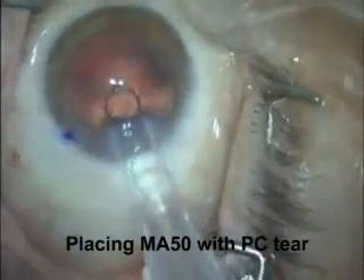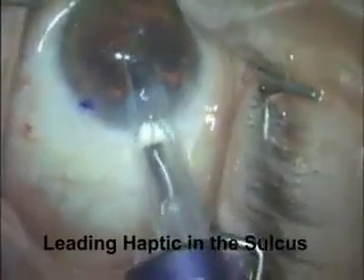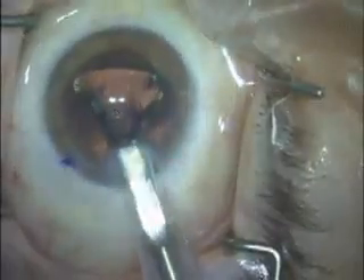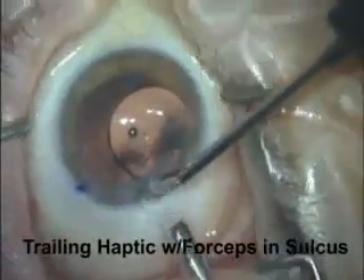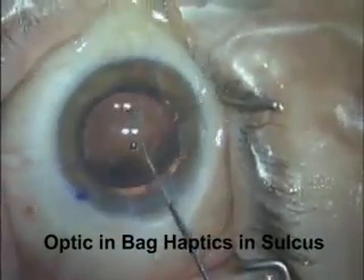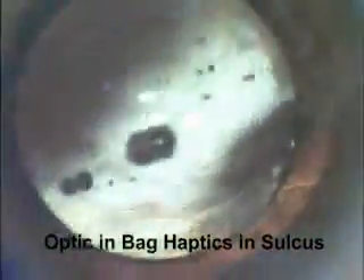Here's a case with a posterior capsular tear. We're placing a three-piece 6.5 millimeter acrylic lens. The haptic is coming out — it's right side up, just under the iris and in the ciliary sulcus. The haptic is in perfect position and the optic is right side up. We're going to leave the trailing haptic out of the eye so that we have good control of the lens. Now we use forceps to place the other haptic in the sulcus so both haptics are in the sulcus. Because we have a very nicely centered anterior capsulotomy, we're going to prolapse the optic posterior so that it's captured and in the bag. Now we have two haptics in the sulcus and an optic in the bag — a nicely centered intraocular lens in a complicated case.